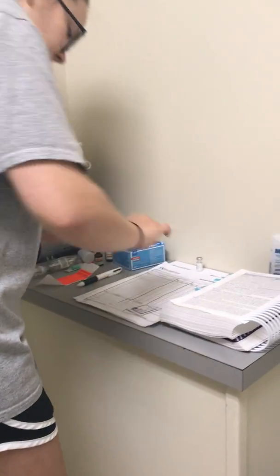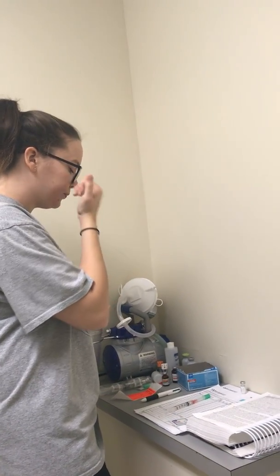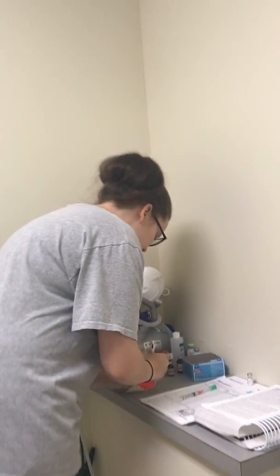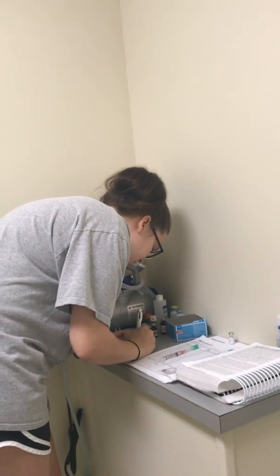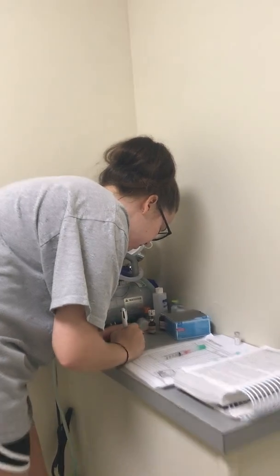0.6. I'm going to recap so everything remains sterile. I'll go ahead and label my syringe, letting it be known that it's morphine at 0.6 milliliters, and I put my initials.